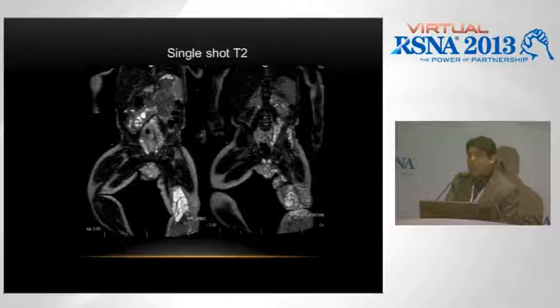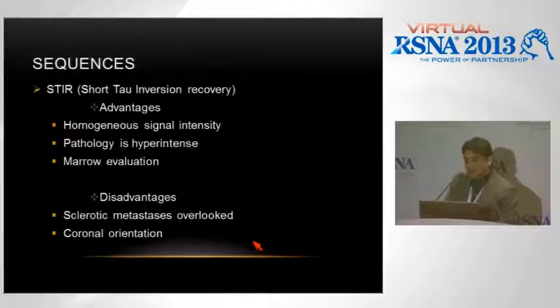So these were some of our original images with Q body, where there was a lot of graininess on the images. The signal was very heterogeneous, and although you can still see that lymphatic malformation on this T2 in the region of the left knee within the soft tissues, now we've optimized the sequences for them to look much better, and I'll show you some of the examples later.